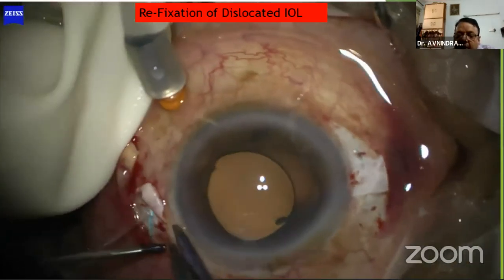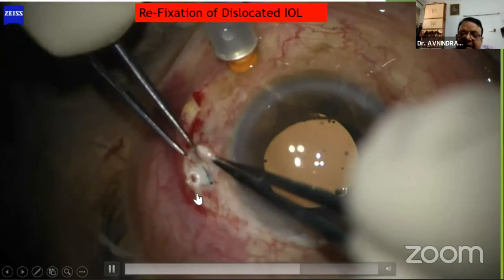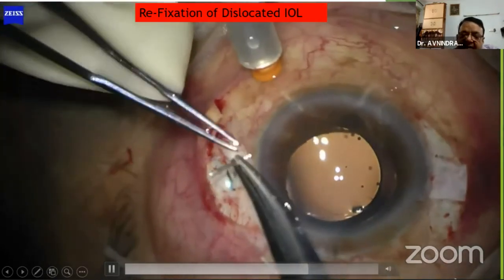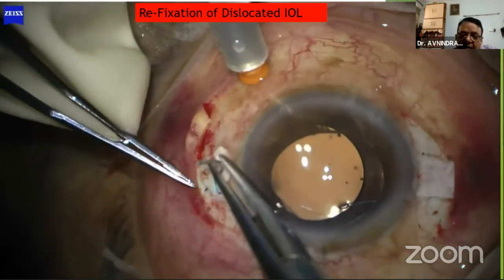And both the haptics are externalized. You can internalize this haptic. And since there is a dislocation, what I prefer in these cases is I put a 10-0 suture for additional stability so that the lens does not dislocate in future.